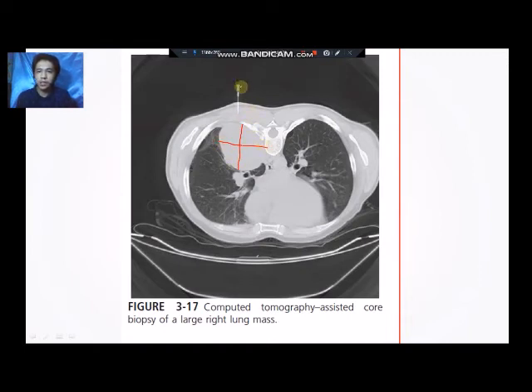And then of course the biopsy needle can also provide samples to evaluate the lung tissue, whether it is malignant or not, or if it is responsive to chemotherapy, or if radiation therapy is more responsive. Okay, and then CT scan would also help us to demonstrate whether the mass is metastatic or just a benign mass.